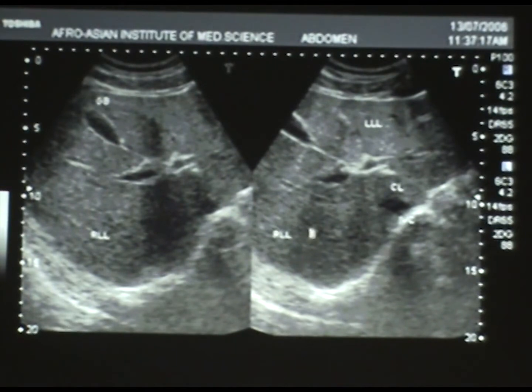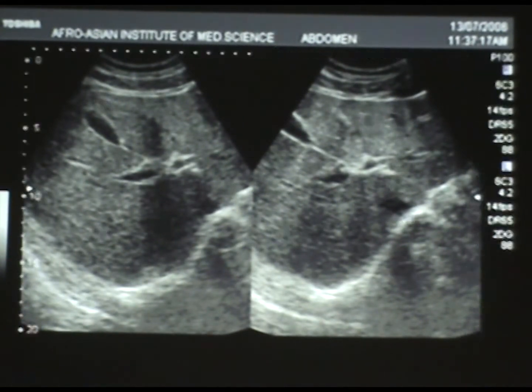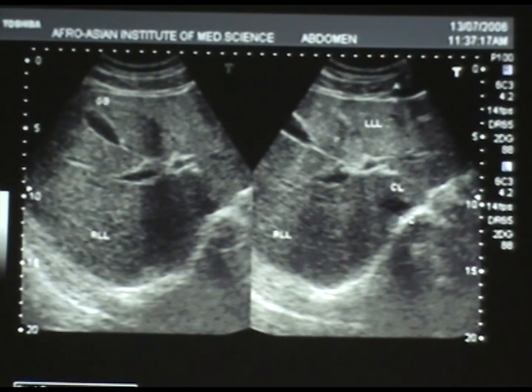6. The 7th measurement is you will put the probe in the mid-clavicular line and you will try to assess the total length, which is normal up to 16 in our countries, internationally 15.4 centimeters. So there is caudate lobe also.